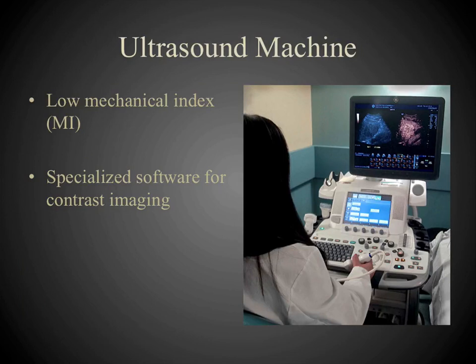The performance of CEUS requires specialized software now available on virtually all high-end ultrasound equipment. The technique is performed with a low mechanical index setting, which induces a stable, non-disruptive oscillation of the microbubble.